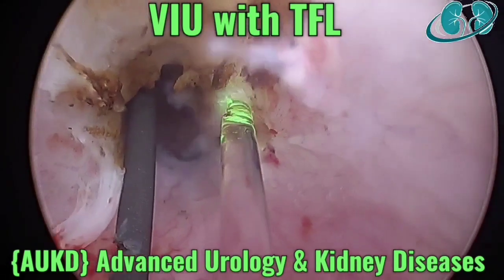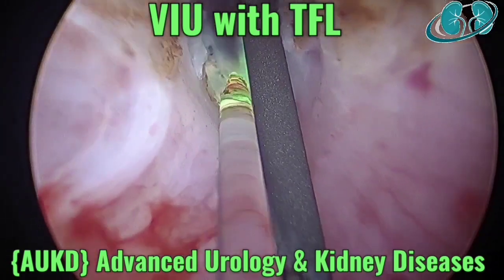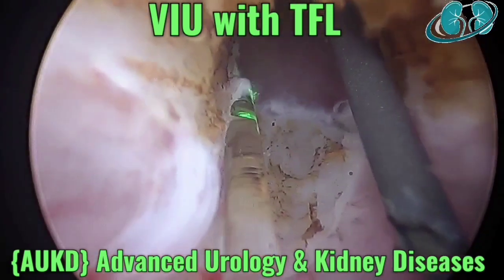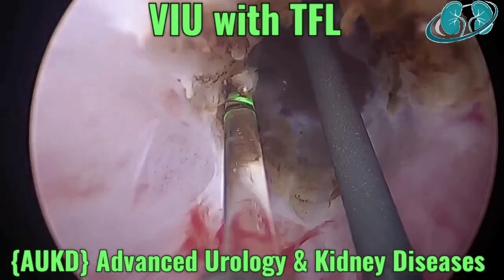You can see the first incision kept at the 12 o'clock position, then 3 o'clock and 9 o'clock. And the beauty of the laser is that we can even keep the cut at the 6 o'clock position also, which is not possible with a conventional technique.